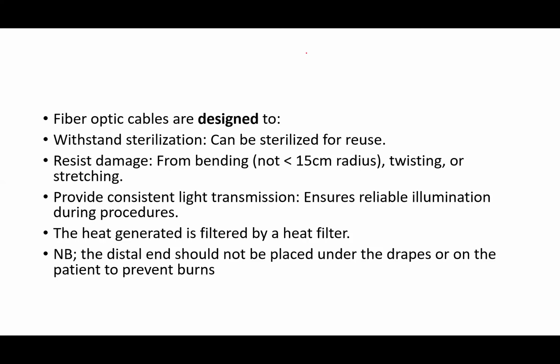We are not talking about autoclaving. We are talking about other methods of sterilization, either enzymatic sterilization or use of glutaraldehyde, Cidex. So it withstands sterilization and can be reused.